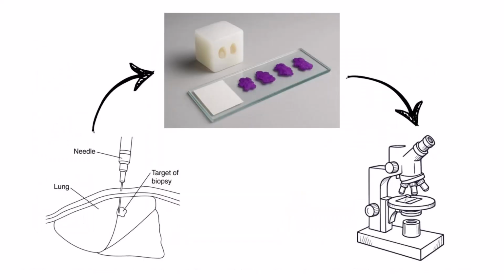Diagnosing lung cancer involves several methods, but the one that provides the most detailed insight is the examination of histological images of lung tissue. In this process, a tissue sample is taken from the patient, either during surgery or via biopsy. The sample is then embedded in wax, sliced into ultra-thin sections, and stained with contrast dyes. These prepared samples are examined under the microscope. The LungHist700 dataset is made up of exactly these kinds of microscopic images.